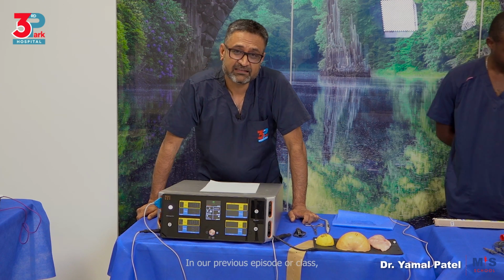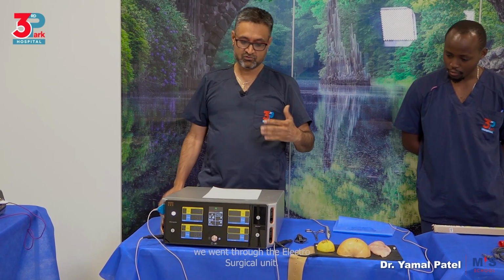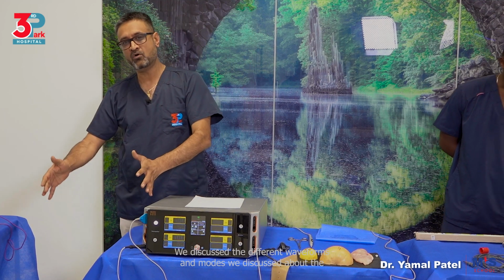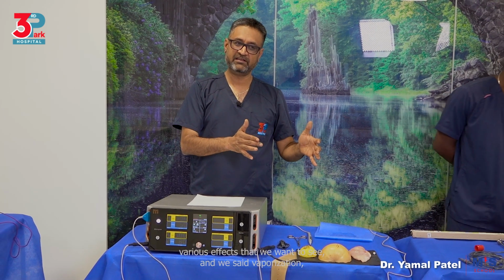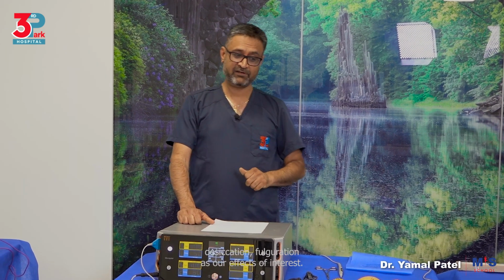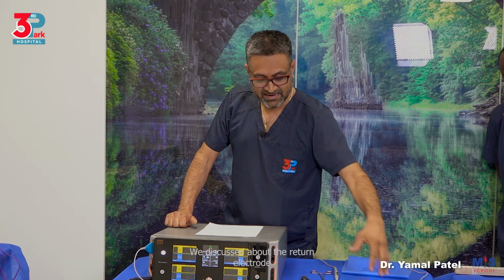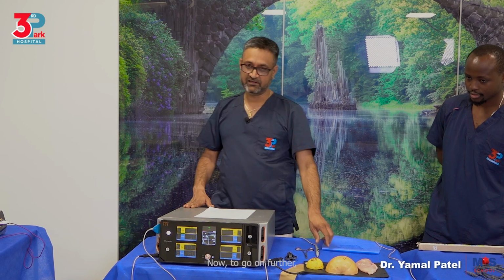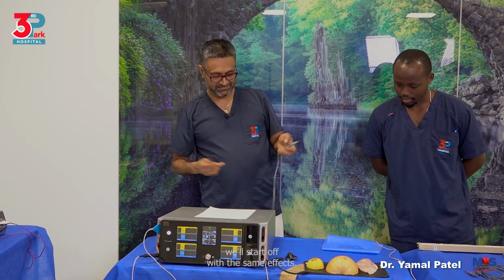In our previous episode or class, we went through the electrosurgical unit. We discussed the different waveforms and modes. We discussed the various effects that we want to see, and we said vaporization, desiccation, and fulguration are our effects of interest. We discussed the return electrode and the monopolar circuit. We discussed the various variables that change the effect that we want on our instrument. Now to go on further, we'll start off with the same effects.